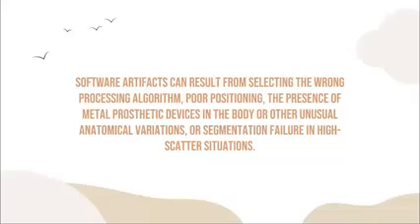Okay? Pag mag-expose ka of two views in one imaging plate, there is this algorithm or software sa inyong computer that can identify the number of orientation or the number of views in one single plate. And that is what we call segmentation, or katong partition pattern recognition software. So, it recognizes na ayaw kanina imaging plate na ay duha ka views. Okay? Kanina kay tulo ka views.